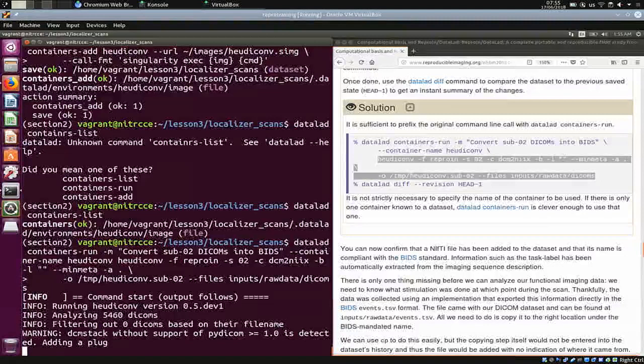It's a little more than a wrapper, but this part here tells it for the actual core conversion it uses dcm2niix, but there's stuff around it like the sorting of the DICOMs etc. that's done. You could achieve a similar result with dcm2niix yourself. You lose a little bit of the convenience. And dcm2niix wouldn't be able to interpret those ReproIn conventions. And the link to those is in the documentation.